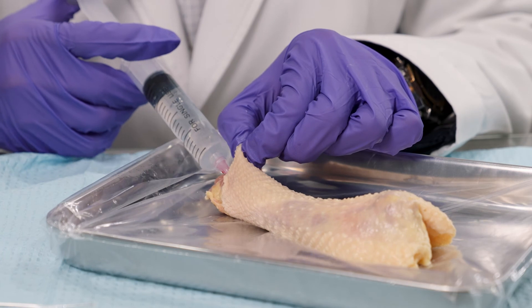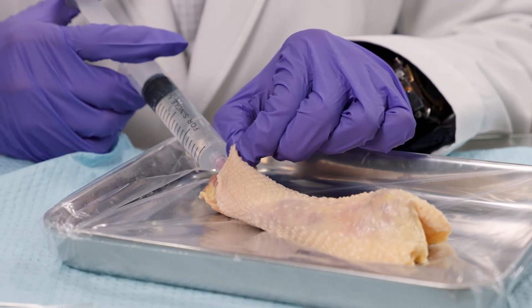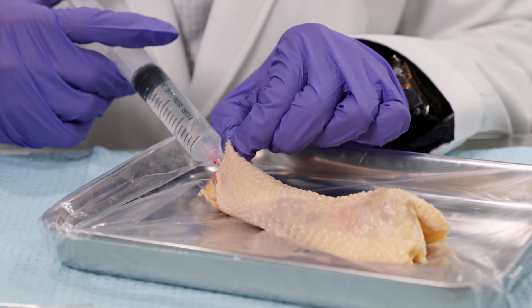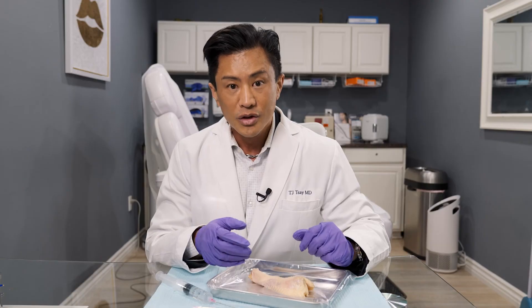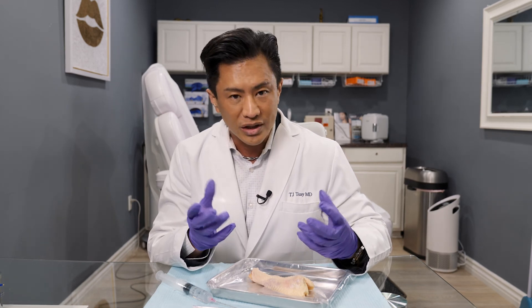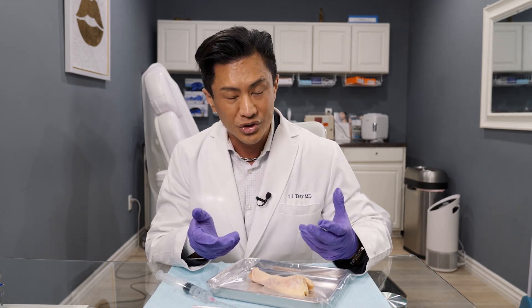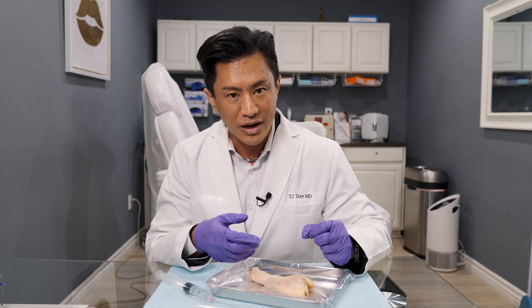There you go — you can see how it's done. I'm putting a little of this ultrasound gel and you can see a slight correction underneath the skin of this chicken neck, which represents how the product is delivered. That summarizes the actual procedure and hopefully gives you some visual insight into how it's done, and maybe even alleviates some fears or preconceived notions about penile enhancement.